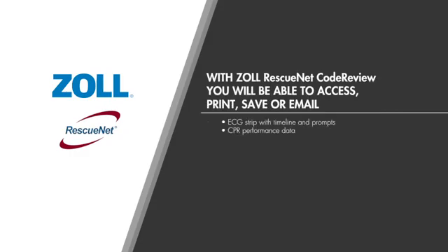With Zoll RescueNet Code Review, you will be able to access, print, and forward ECG data from the patient event that includes an ECG strip with corresponding prompts that were given by the AED Plus. This information can be valuable to medical personnel in the ongoing treatment of the patient.